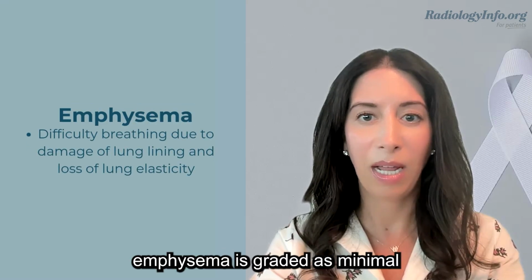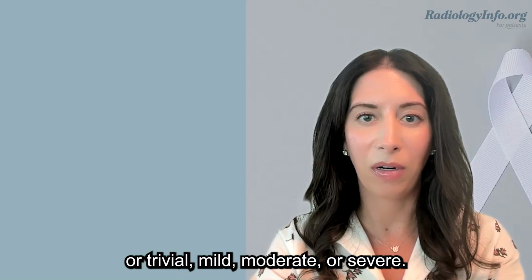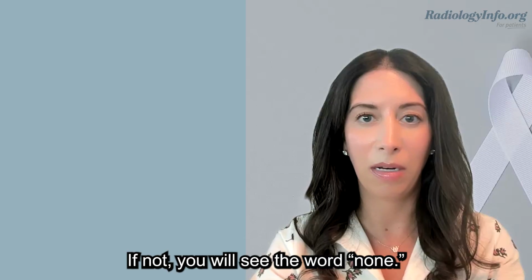Emphysema. If present, emphysema is graded as minimal or trivial, mild, moderate, or severe. If not, you will see the word none.